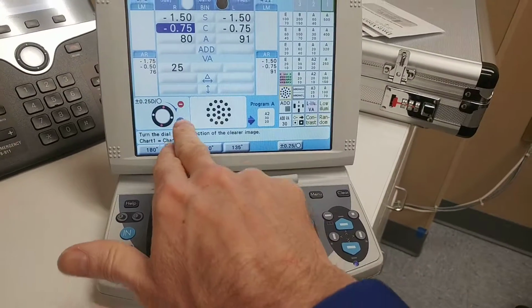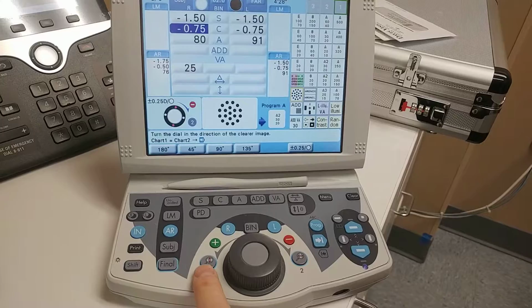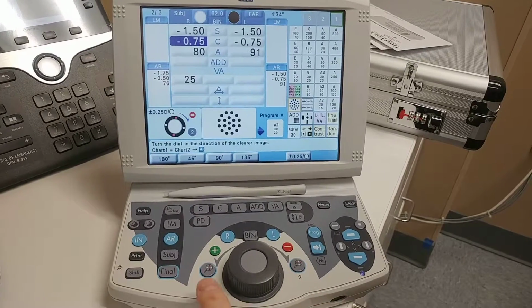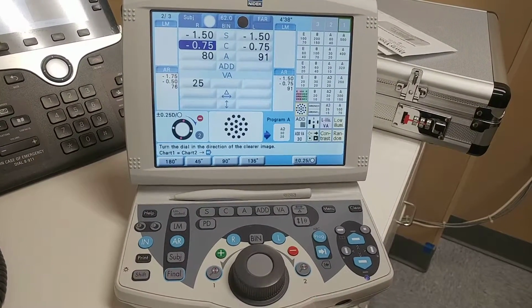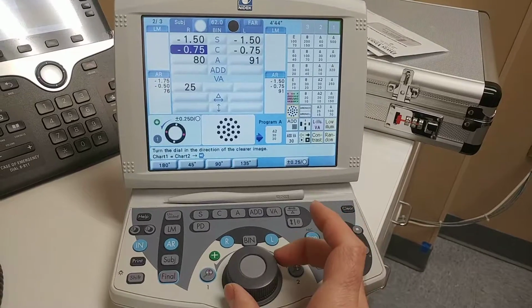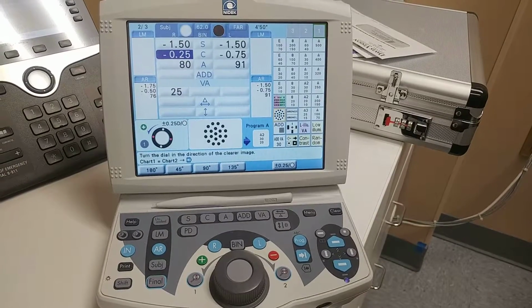And again, this tells you which it's on right now. So red, you're going to add more minus, and green, you're going to add plus. So it's on this one here. I'll say, are the dots better with 1 or 2? Let's say they say 2, to the green. I turn it 2 clicks to the left. That makes it a quarter amount of cylinder.